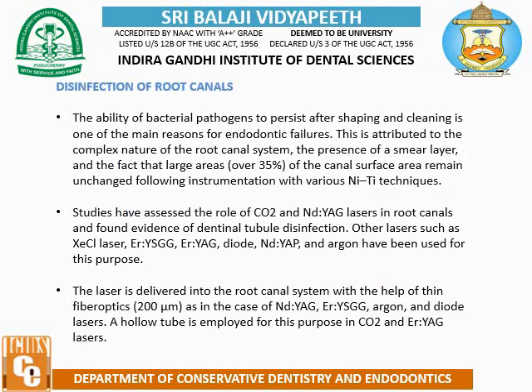Disinfection of a root canal. The ability of the bacterial pathogens to persist after shaping and cleaning is one of the main reasons for endodontic failure. This is attributed to the complex nature of the root canal system, the presence of smear layer, and the fact that large areas, over 35% of canal surface area, remain unchanged following instrumentation with nickel titanium technique.